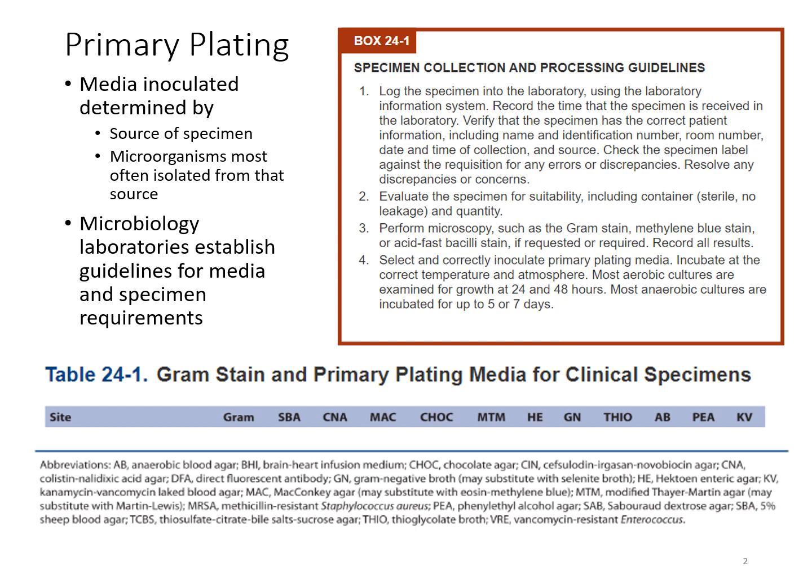Now, for some of the different media that are differential, a lab may choose one type over another for whatever reason, so there's not really a right or wrong way to decide exactly which media to use, because there are a couple of different ones. But for the most part, all labs are going to use something like a sheep blood agar and a MacConkey, CNA, chocolate, those kinds of things that are more supportive or more widely used. But as far as doing some of the identification of some of the organisms based off of different media types, that will be just preference for that particular laboratory.